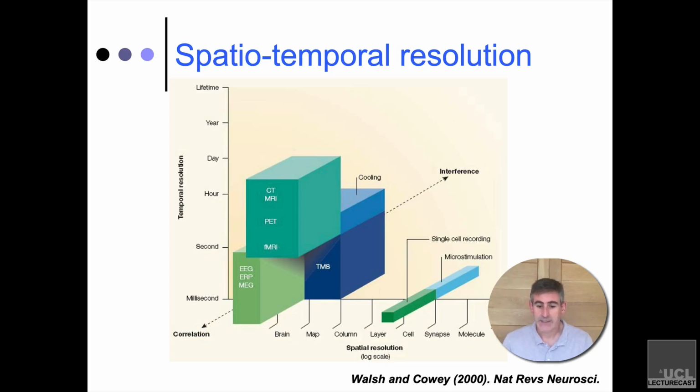But what's interesting is that imaging techniques like EEG, electroencephalography, magnetoencephalography, and versions thereof, have a spatial resolution that's somewhere between centimeters and whole brain, right? And to the extent that there are times when you cannot accurately tell that a signal in an EEG system has come from either the left hemisphere or the right hemisphere, right?